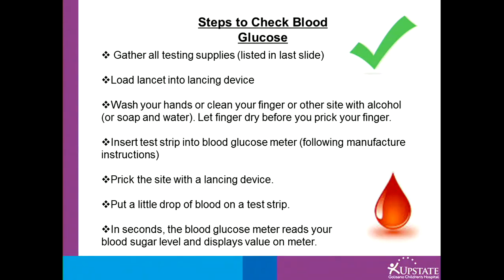Insert your test strip into your meter. Prick the site with the lancet device — usually fingers are suggested — and put a drop of blood on the test strip. In seconds, the meter will give you your reading.